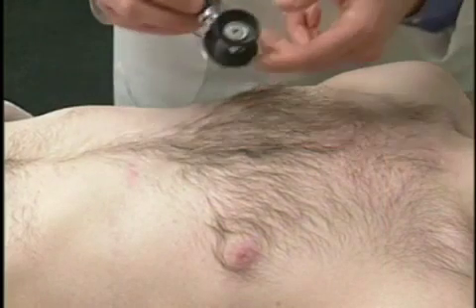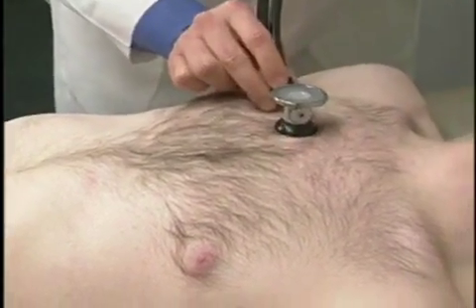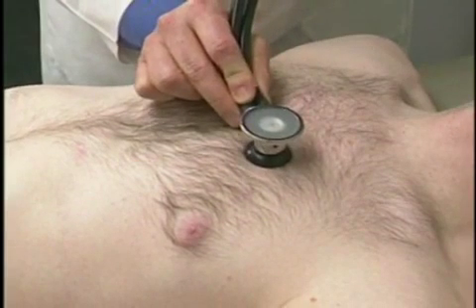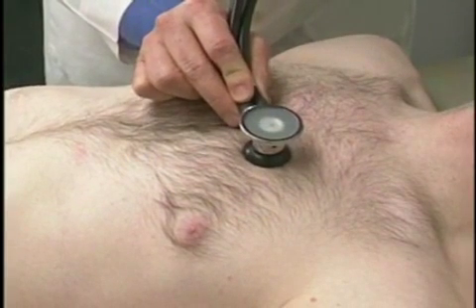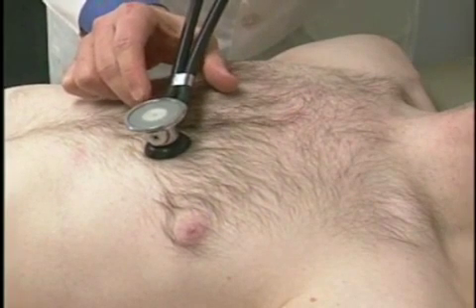And I'm going to repeat all of those by listening with the bell of my stethoscope. You'll notice with the bell, the stethoscope just gently rests on the skin. No pressure needs to be applied.